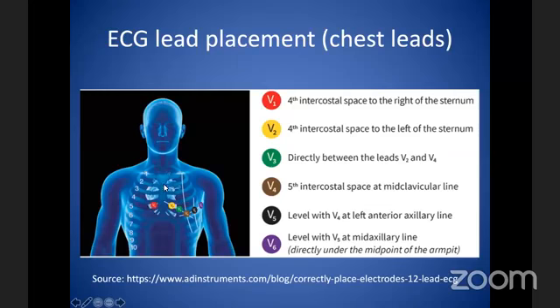Imagine something looking from here, something looking from here. We'll look at the same thing, but in a different way. So imagine if there's a car parked here. One guy is standing here. He will look at the front of the car, but this guy will be looking at the side of the car. So that's how ECG leads look different from each other.